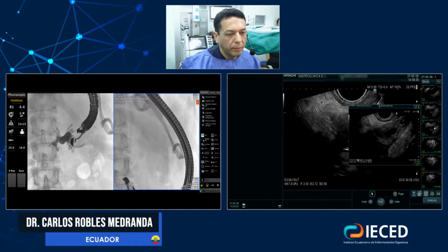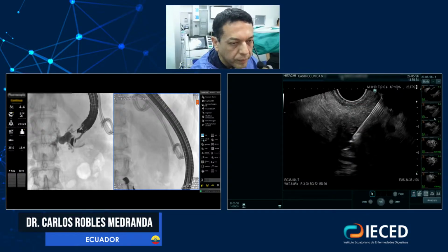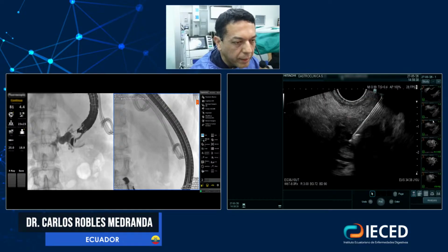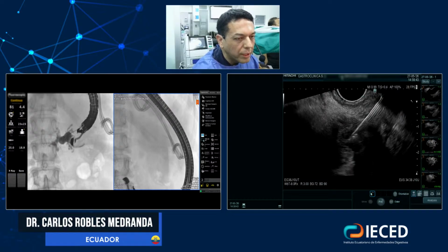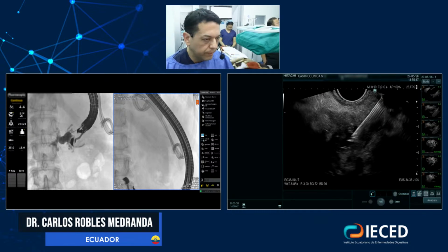And second, when I was looking here, I didn't see it a little bit, but when I was looking inside, I saw a communication. So that's why there's still a persistence of the pseudocyst.